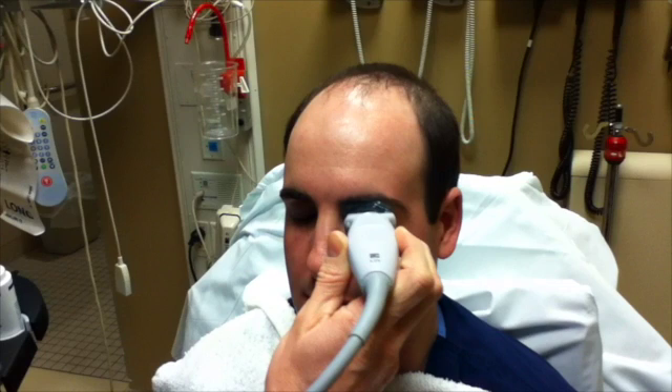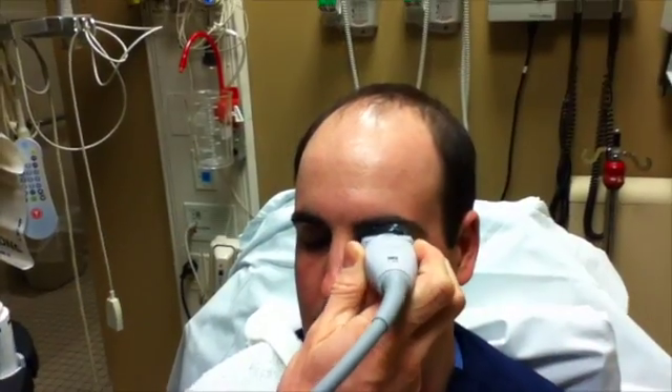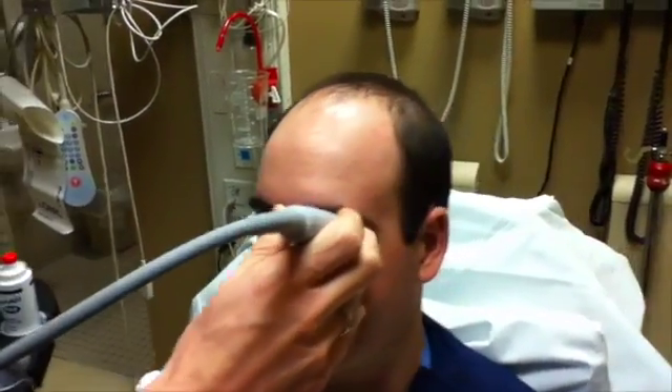Gently place the linear probe transversely across the eye with the probe orientation to the patient's right. Be sure to anchor your hand somewhere on the patient's face. This will avoid the probe inadvertently sliding as well as avoid undue pressure on the eye. Rock the probe up and down to scan completely through the eye.